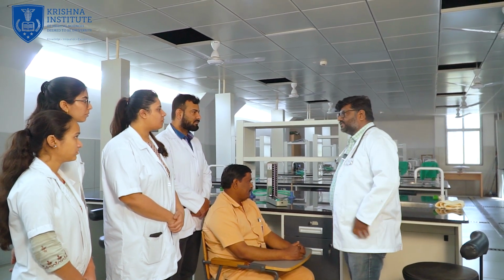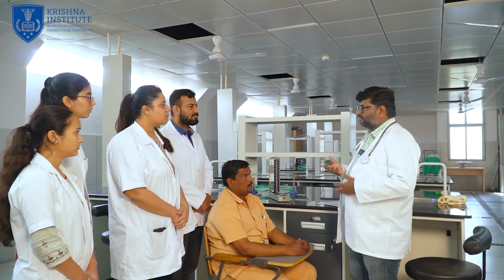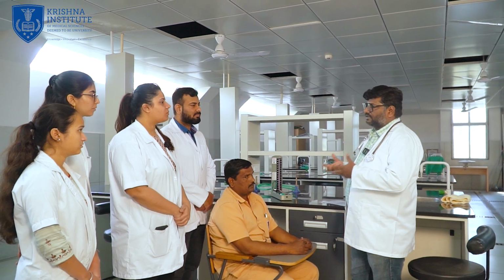First thing is to introduce yourself. Introduce yourself, what you are and what is your role in measuring the BP.